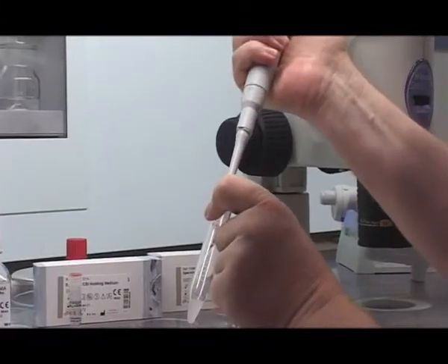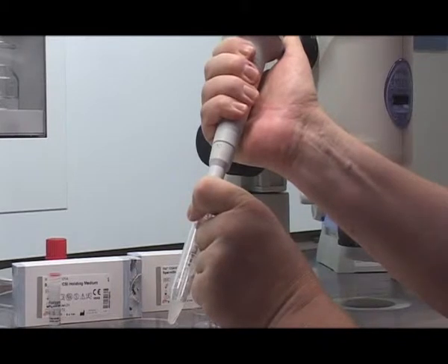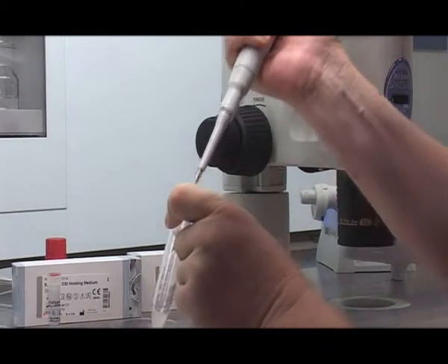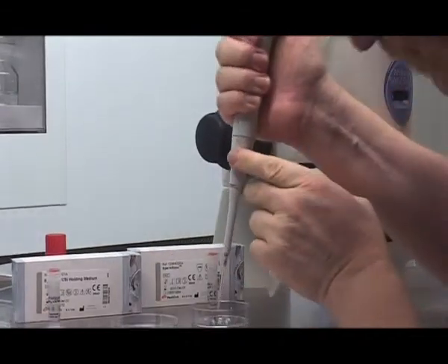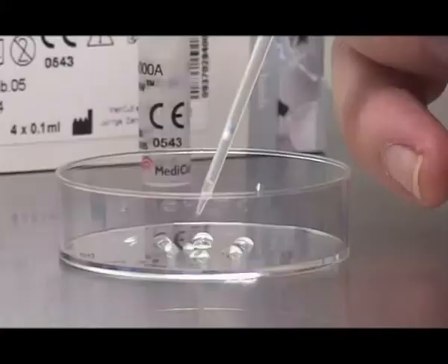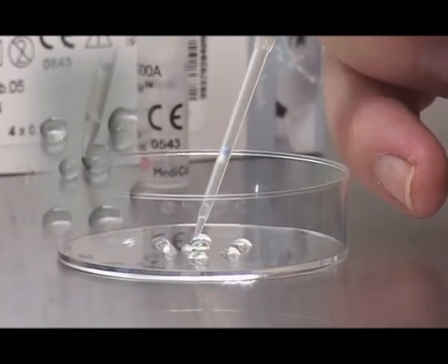Aspirate the selected volume of the sperm suspension. Place the sperm suspension close to the SpermSlow drop located in the centre of the dish and create a junction between SpermSlow and the sperm suspension.